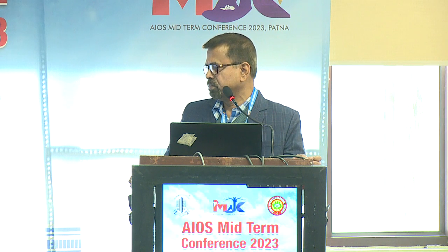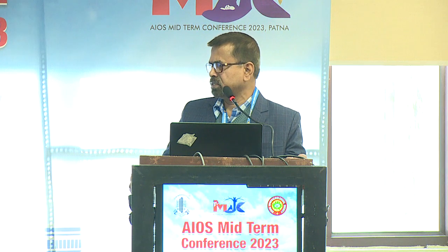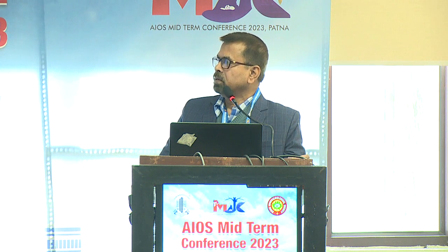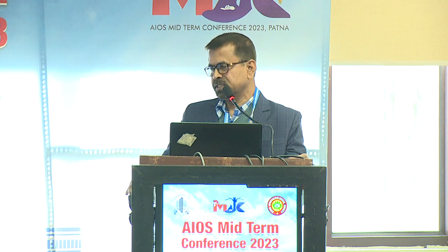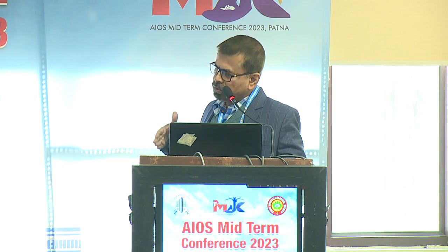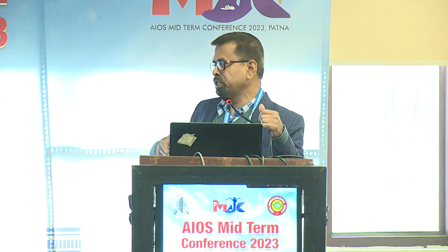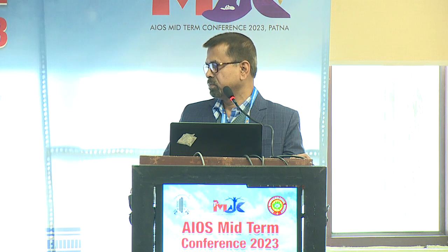You also use a sharp kind of chopper, it really works when it comes from the periphery. If you do a central chop, the sharp chopper really works because it cleaves your nucleus very nicely. But this technique is a little bit different. You go from the periphery, you do a peripheral chop. And I go near the chopper at the periphery. The phaco needle goes near the chopper. So the needle traverses most of the nucleus, not the other way. Yeah, okay, right.